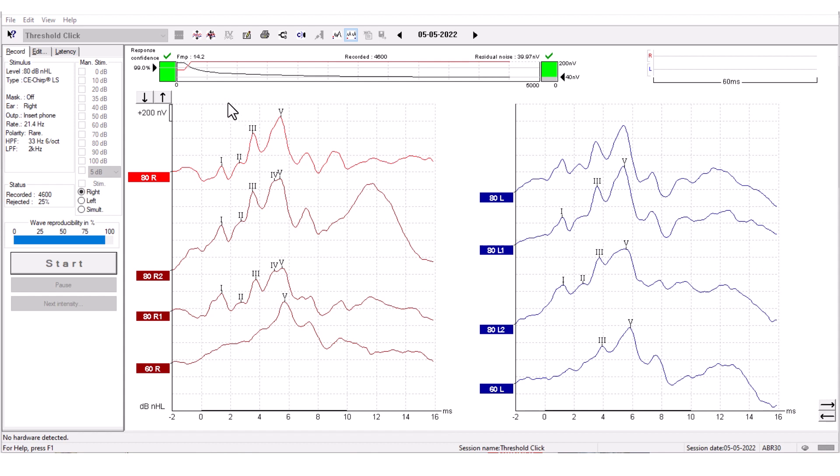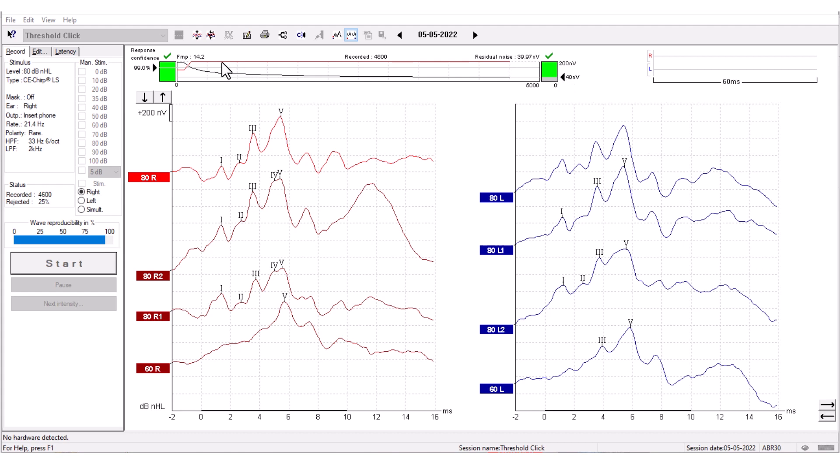The FMP and Residual Noise graph in the top of the screen acts as a quality measure for each waveform. A high quality waveform has a high FMP and a low residual noise. The bars will turn green when the FMP and Residual Noise reach their stop criteria. When this happens, you can be confident in the presence or absence of the response.